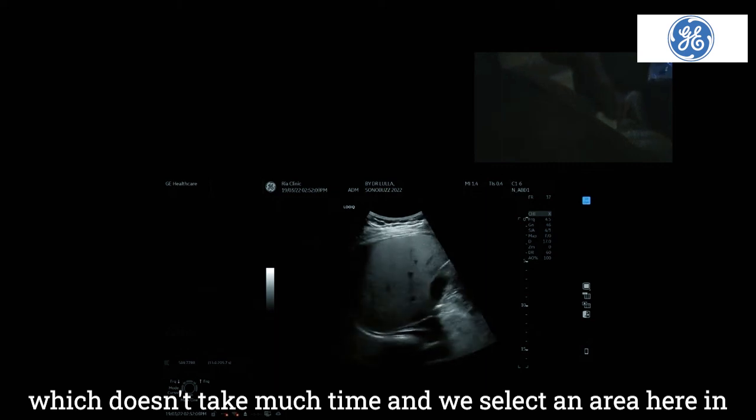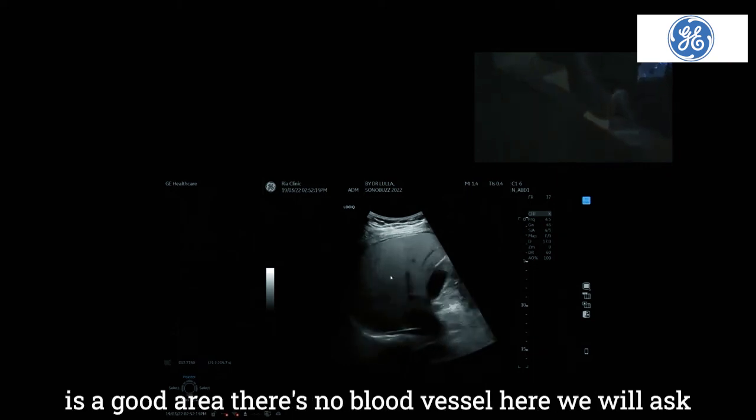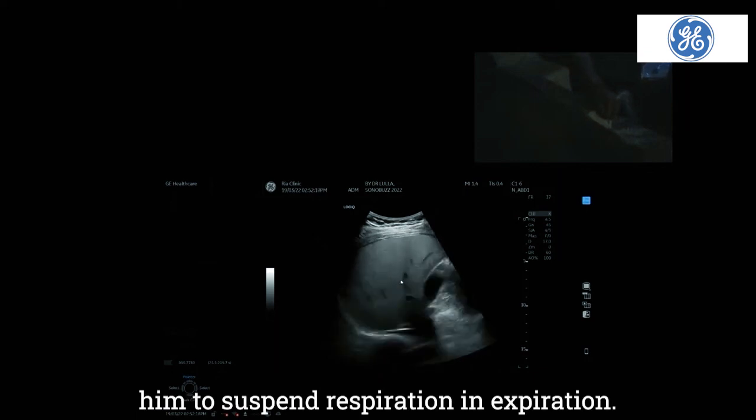And we select an area here in segment 5, 6, or any area here, 7. I think this is a good area. There's no blood vessel here. We will ask him to suspend respiration in expiration.